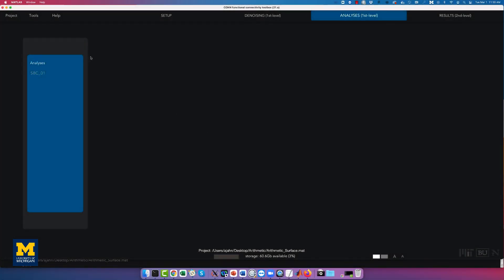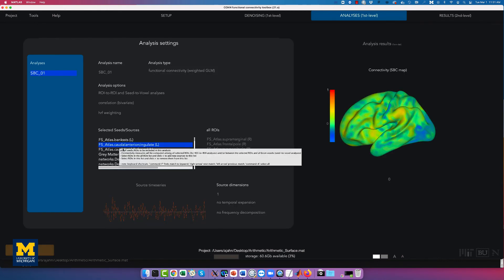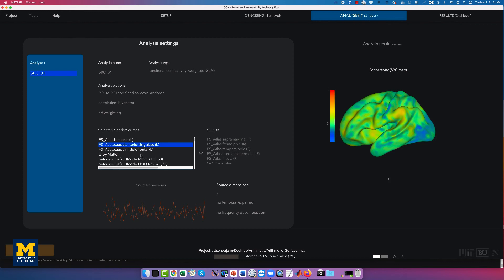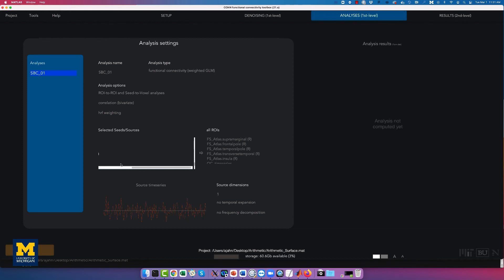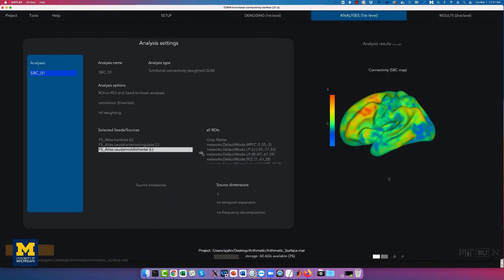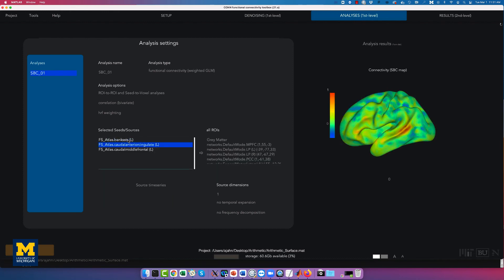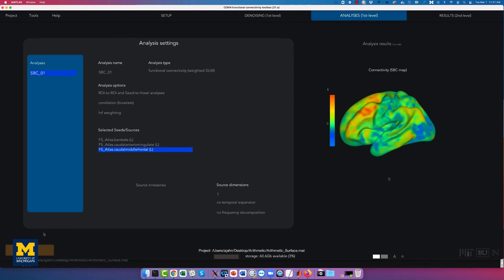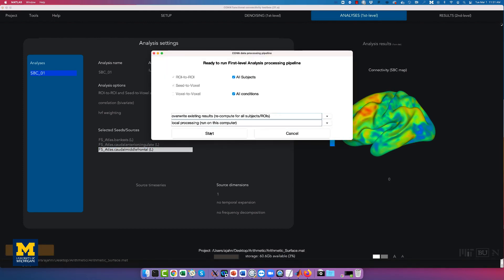The denoising tab will be the same as during the volumetric functional connectivity analysis, and the interpretation of connectivity distributions and principal components analysis is the same. The only difference is that you will see the BOLD variance projected onto a surface for each subject instead of their volume. Click done to proceed to the first level analysis tab. The first level analysis will also be very similar to the volumetric analysis, except that results are projected onto a cortical surface. To save time for the group level analysis, remove all selected seeds and sources except for the first three ROIs listed in the FS Atlas. Click done to proceed to the group level analysis.